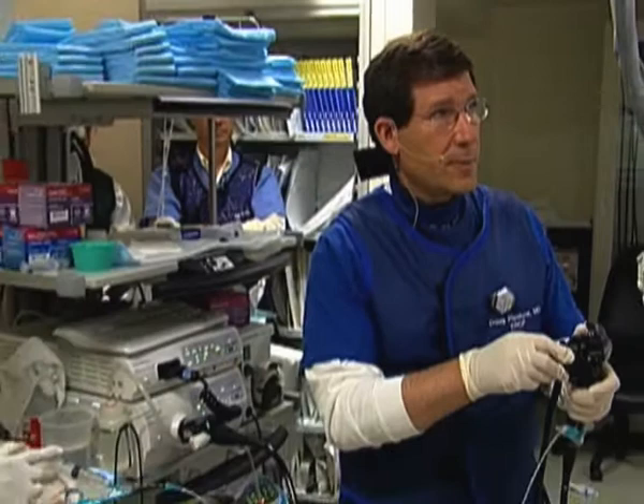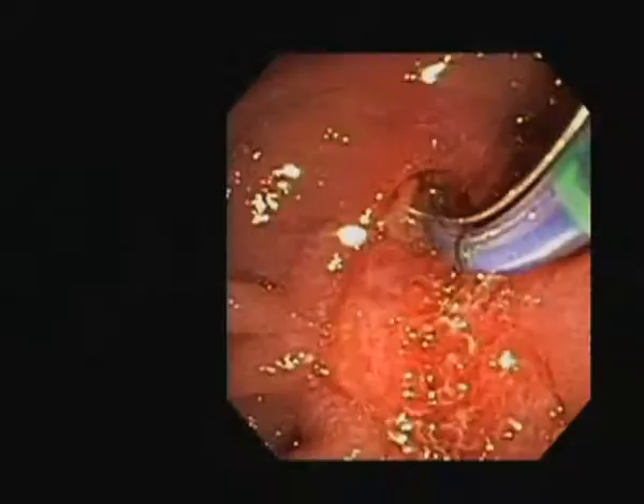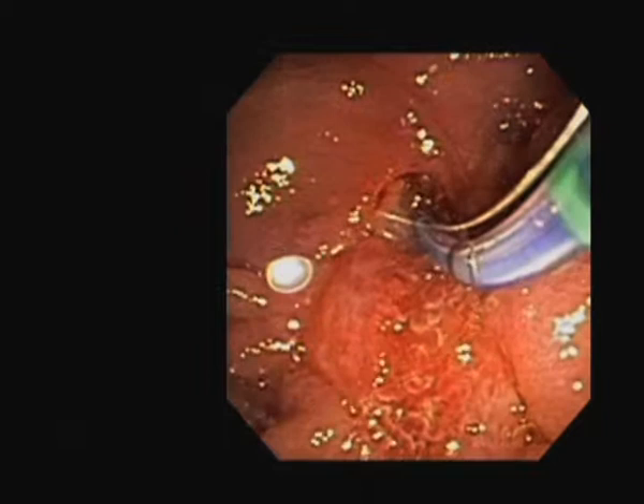So we're going to do a cholangiogram initially, identify the bile duct and the stones, and then characterize what we need to do as the next step. I generally use a sphincterotome for all my cases — it just gives better access to the bile duct. I like the Autotome 44 sphincterotome. And here's the sphincterotomy.